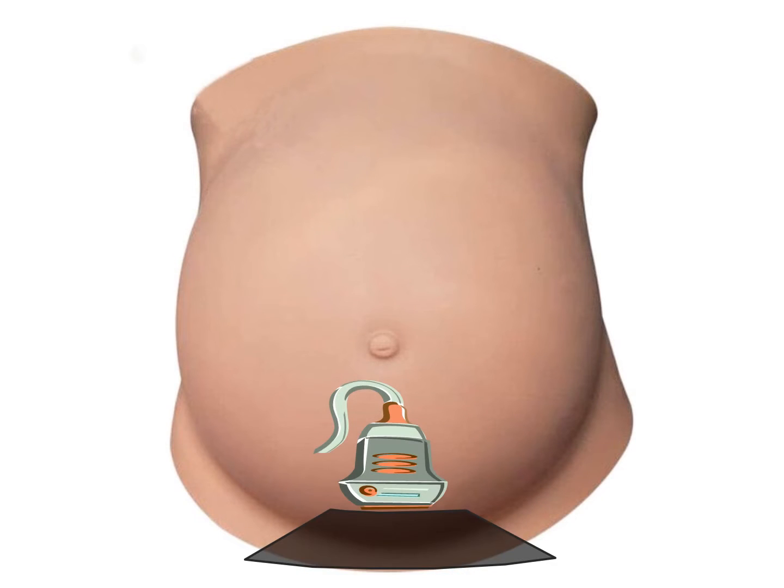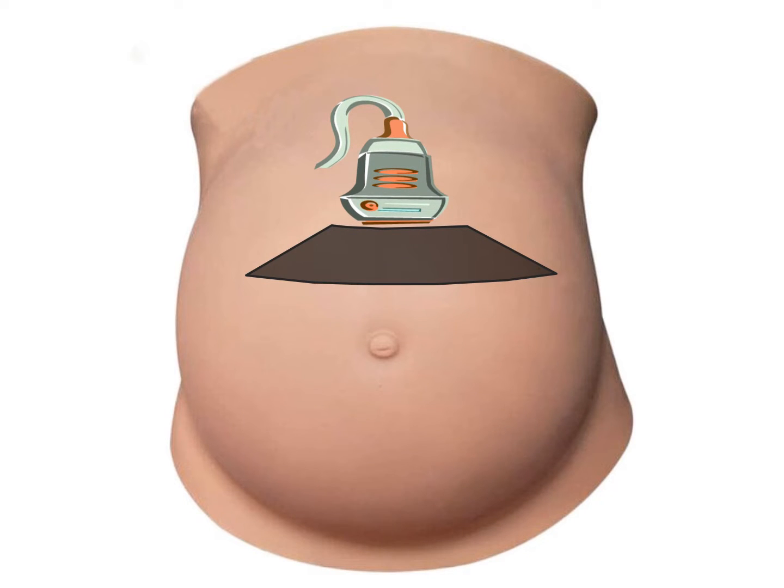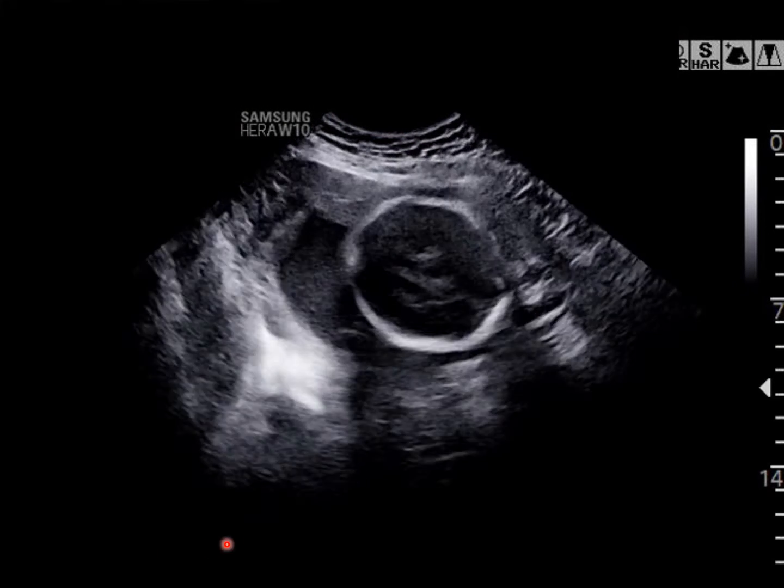Now again, we'll start at the lower end of the abdomen in the pelvic region, transverse marker at the maternal right side, and perform our fundal sweep, and that means sweeping up the abdomen to the top of the abdomen to the fundus of the uterus. And this is what the sweep should look like.